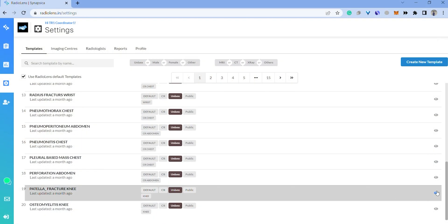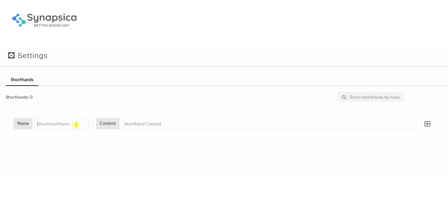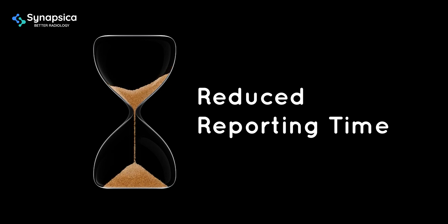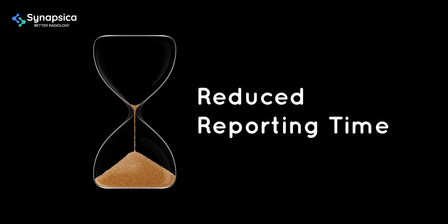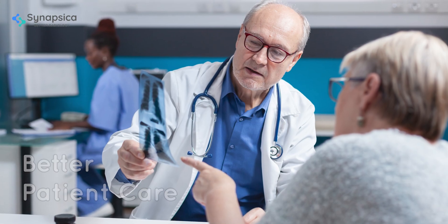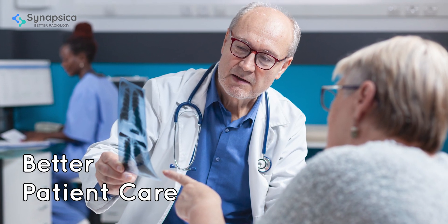In addition to making your viewing experience and workflow better, Radiolens comes equipped with predefined customizable templates, macros, and shorthands which reduce your reporting time and let you focus on providing clinical insights and better patient care.